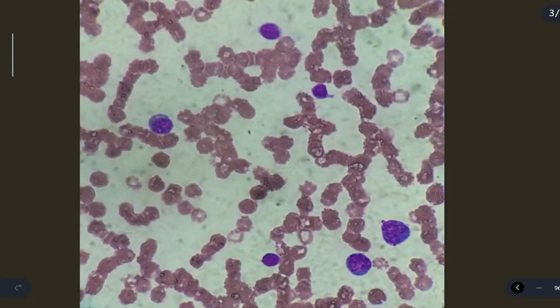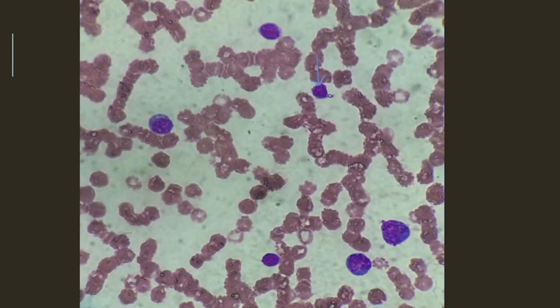Here again, another picture showing — we can appreciate a mature lymphocyte with a condensed blue nucleus, and the cytoplasm is very scanty, not appreciable. So here is a mature lymphocyte with condensed chromatin.